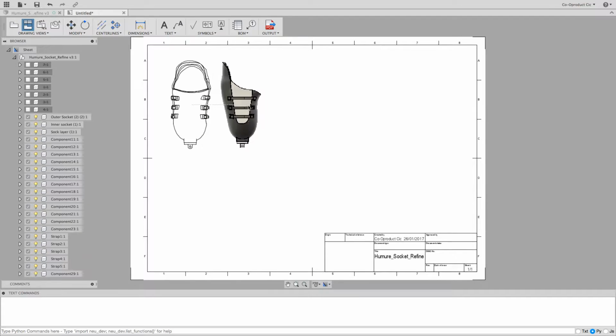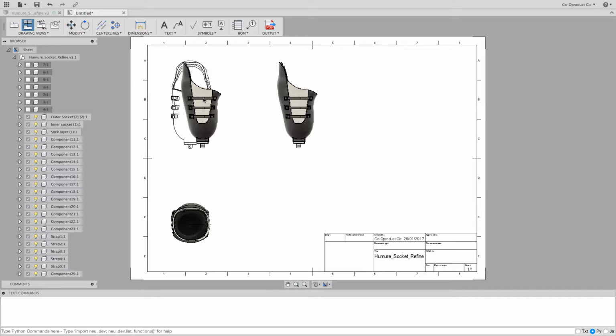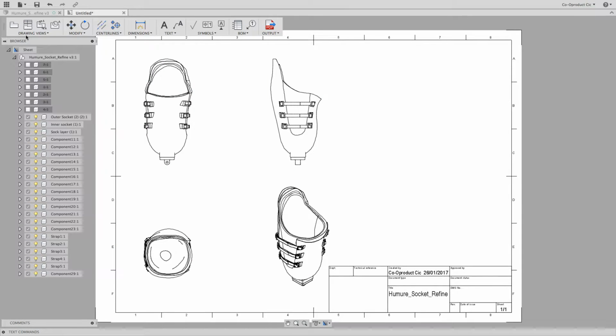So if we drag to the right, we get a side view. If we drag diagonally, we get a perspective view. If we drag down, we get a top view. I'm going to click to place the top view here. Then I drag up over the base view, and then right, and click to place the side view here. And I'll place the perspective view here. I press Enter on the keyboard to confirm those views.